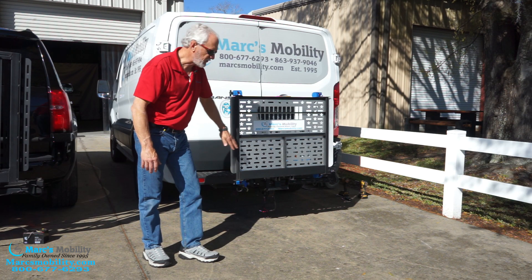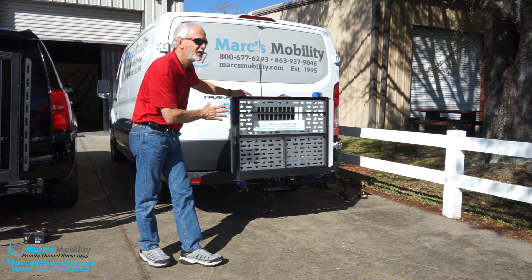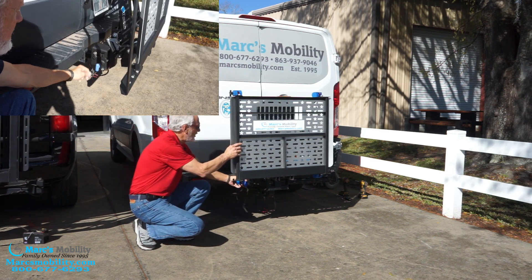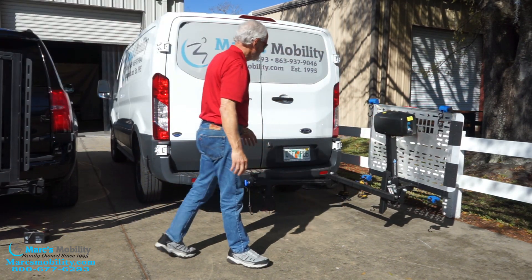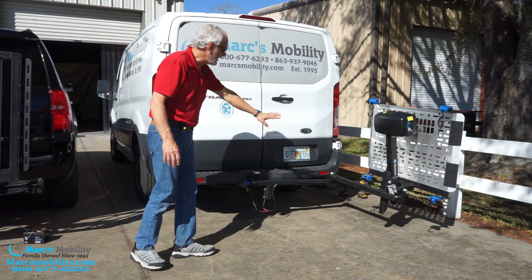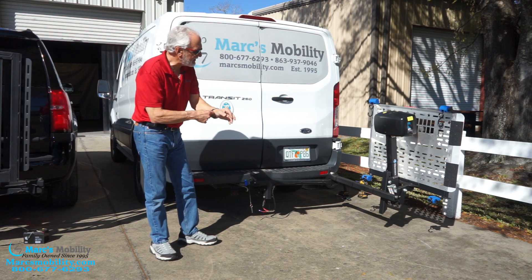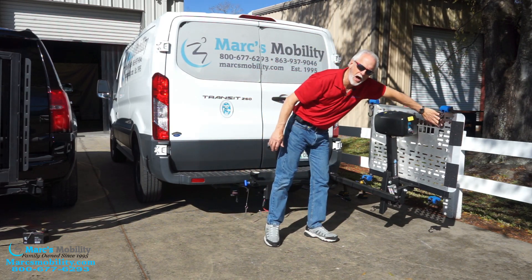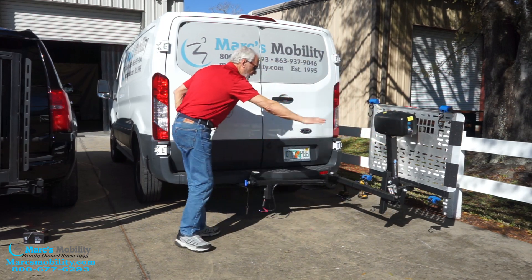This one here has a swing away option. What that means is you pull the pin out, pull the handle out, and you can open the lift up so you can open your tailgate, your hatchback, or on this minivan, you can open the back doors. When you swing the lift open like this, you want to do that with no power chairs on here at all, because if you do that too many times you're not going to be able to shut the lift properly — like a pair of scissors.